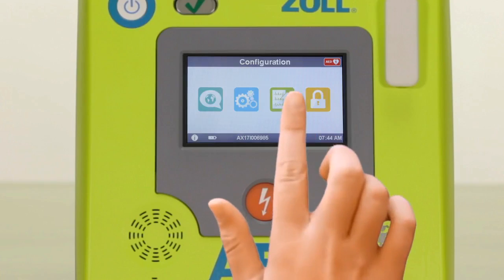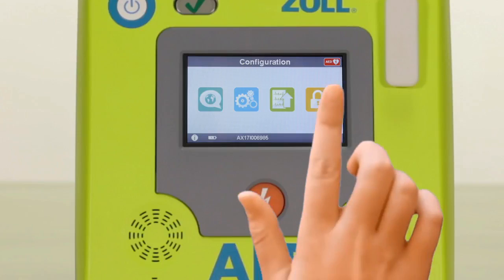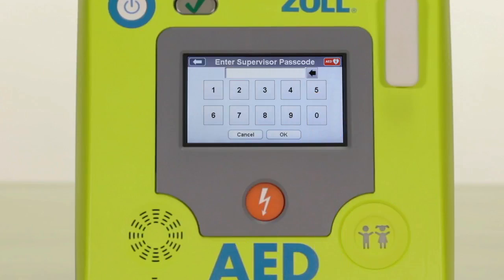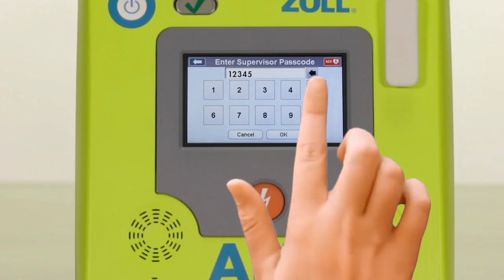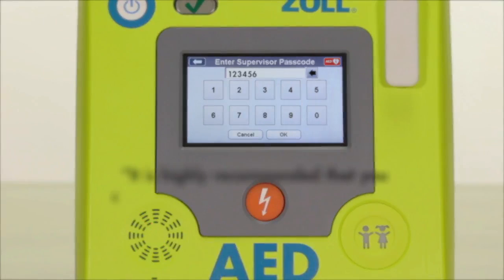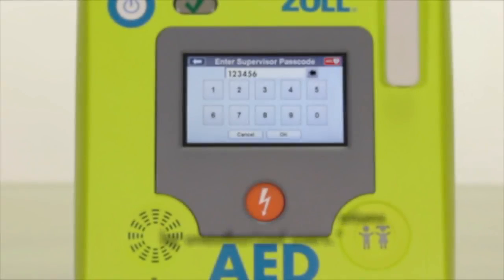Selecting the blue gear icon will open the basic configuration screen. In this screen you will see four icons. The last icon on this screen is the locking feature that allows only authorized users to access the advanced configuration features of the AED. Press the yellow lock icon and enter the passcode. The default passcode on a new ZOL AED3 is 123456. If you wish, you can create your own passcode in the advanced configuration settings, which we will cover later in this video.